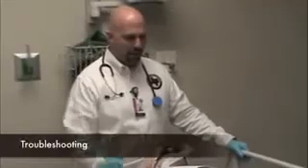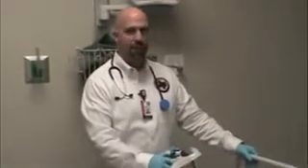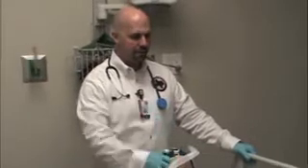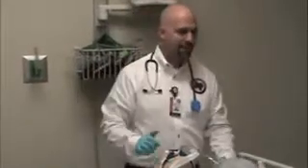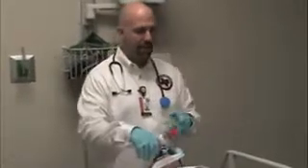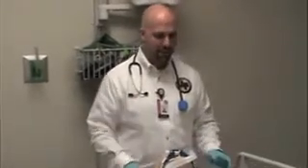Some troubleshooting things. You never want to troubleshoot a ventilator problem with a patient attached to the ventilator. If you start noticing vital signs changes, you would want to take your bag valve mask, hook it back up to your oxygen source, take the patient off the vent, and bag them while you figure out what your problem with the ventilator is. It's always a really bad idea to try to troubleshoot the vent with a patient attached to it.